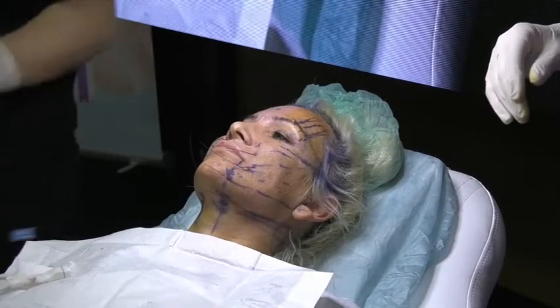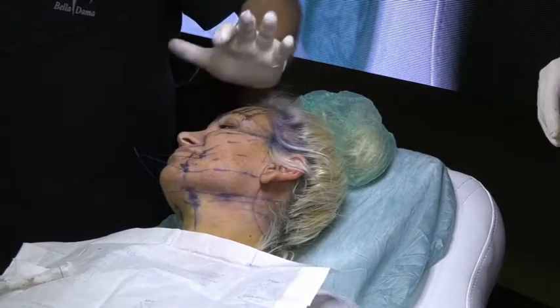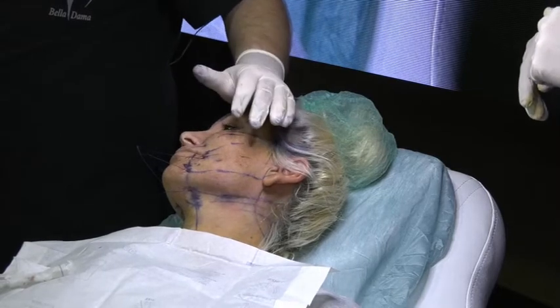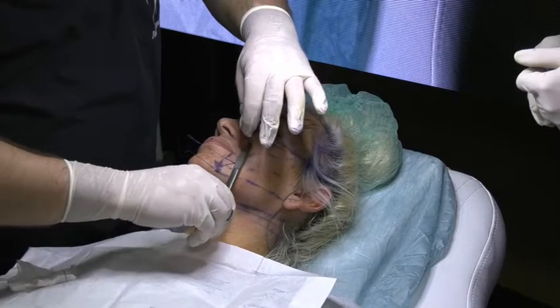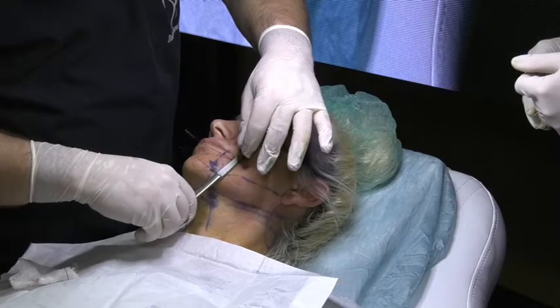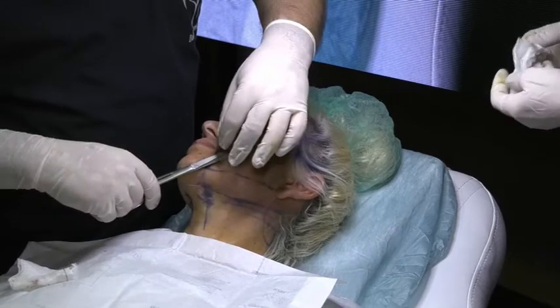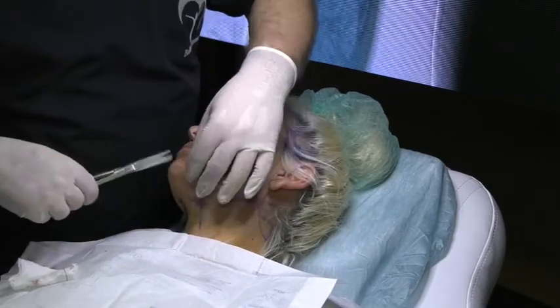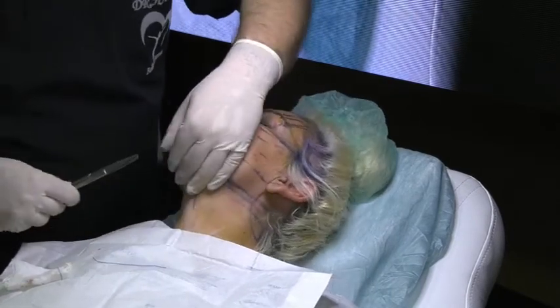Look at this dimple. You like it? I don't. Just look. When this happened today or tomorrow or any day, from up to down it will go.